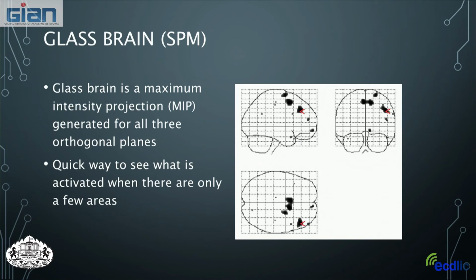When I started using fMRI, these were a little bit confusing to me, but I get a more general idea now. You can see that a lot of the activation due to whatever task they were doing here is more in the mid to front range of the brain, and they seem to be more on the right side. On the axial view again, you can see that it's more towards the front right of the brain. Does that make sense to everybody?